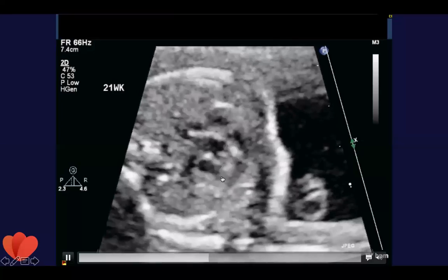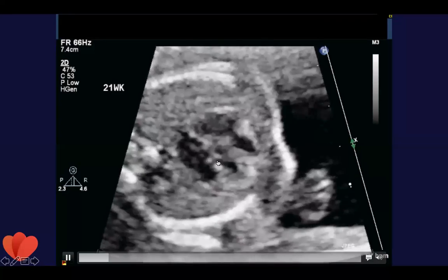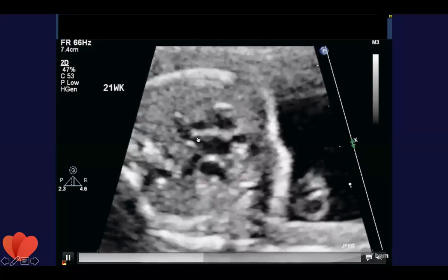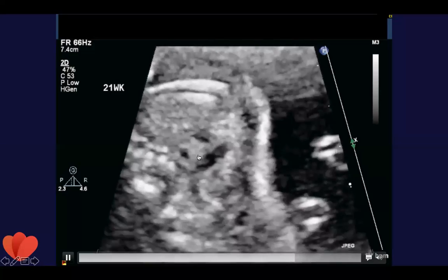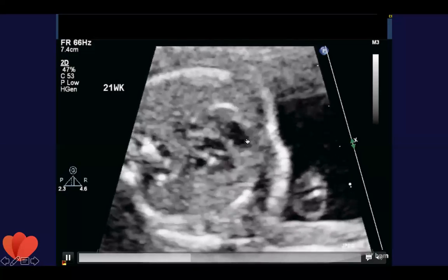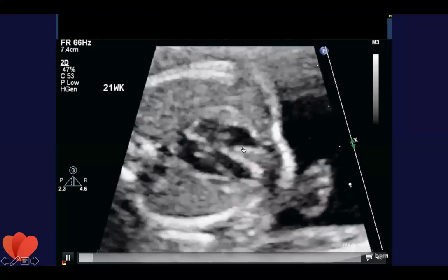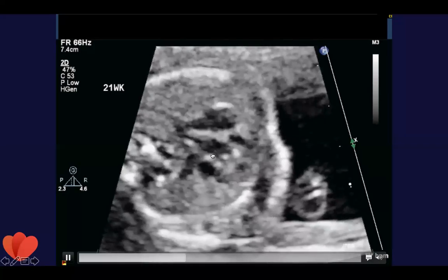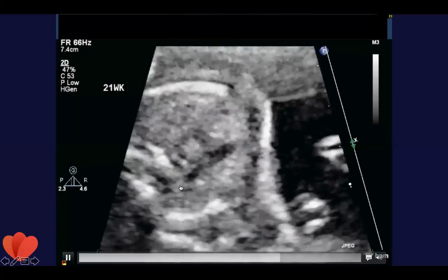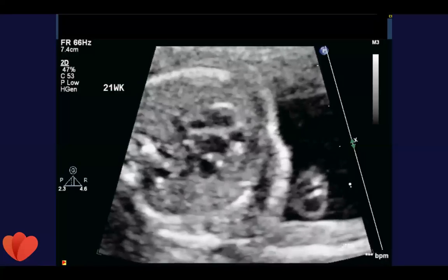Again, here's your spine. We're going to start in the left ventricle and watch it play. The first great vessel we see branches into left and right pulmonary arteries. This is coming from the left ventricle. Now we move our attention to the right, and we see that the semilunar valve does not branch at all and gives rise to an aorta. So this is an example with sweeping of transposition of the great arteries.